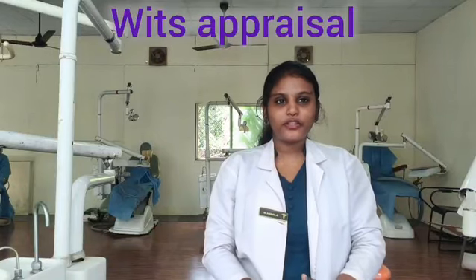Wits Appraisal is an orthodontic cephalometric measurement used to assess the anterior-posterior relationship between the upper and lower jaw, independently of the cranial base landmarks. It was developed by Alexander Jacobson at the University of Witwatersrand in South Africa.